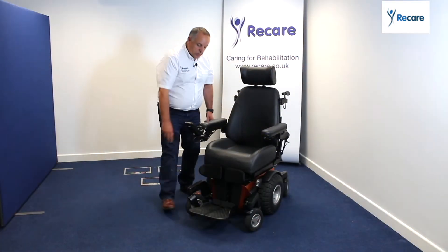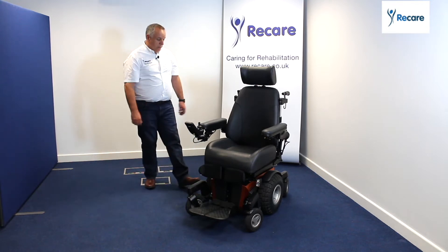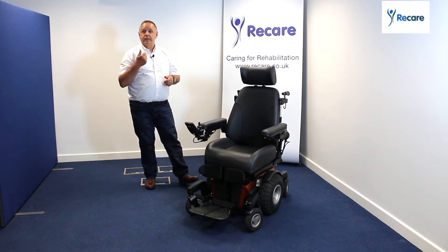We can change and adapt all the leg rests to power and non-power if that's what we want. But more importantly, the next section is the seating system here, which has all the different functions — you can have tilt, lift, and recline.